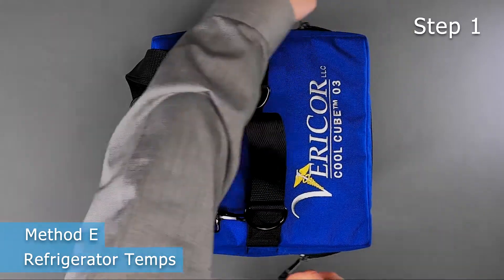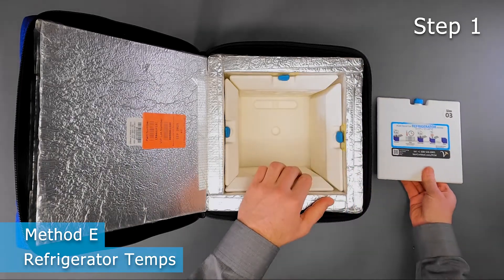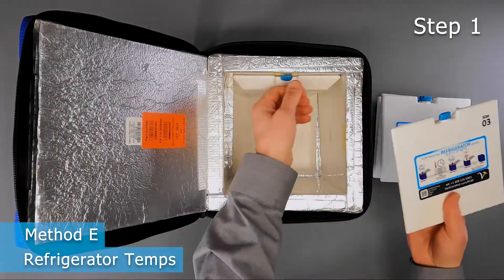Method E is precise and produces the longest hold time possible, but it requires constant monitoring and careful attention to detail. Total time for this method is just under 3 hours.